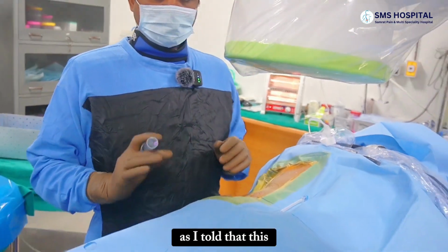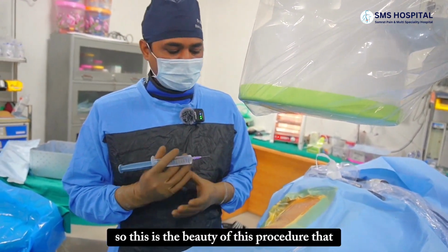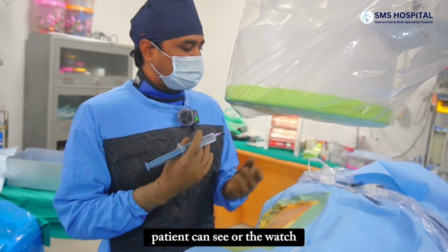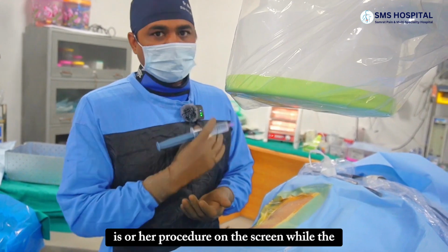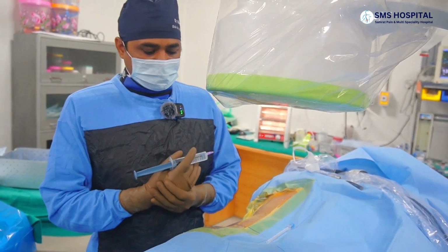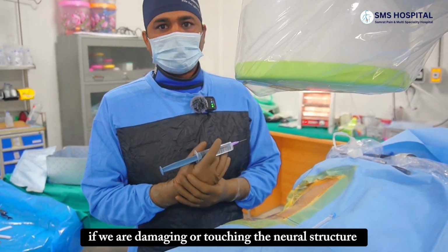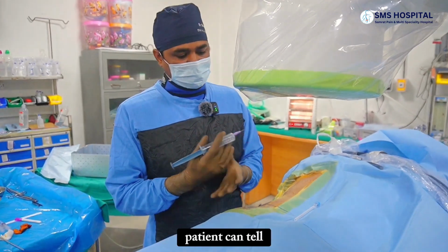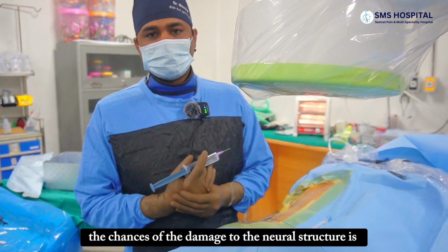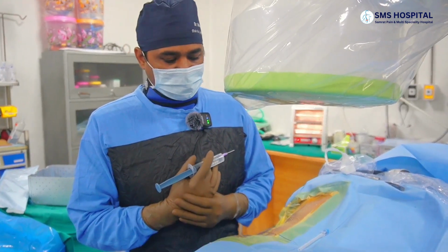As I told, this procedure is carried out in local anesthesia only. This is the beauty of this procedure, that the patient can watch his or her procedure on the screen while the surgery is being done. And if we are damaging or touching the neural structure, the patient can communicate. So the chances of damage to the neural structure are very rare, or you can say very less.